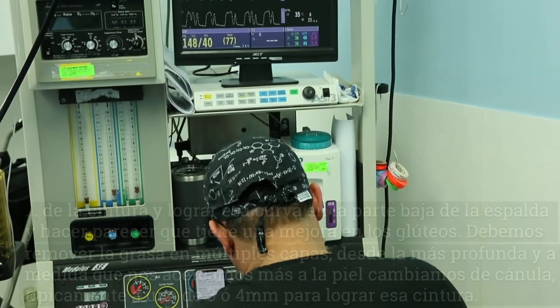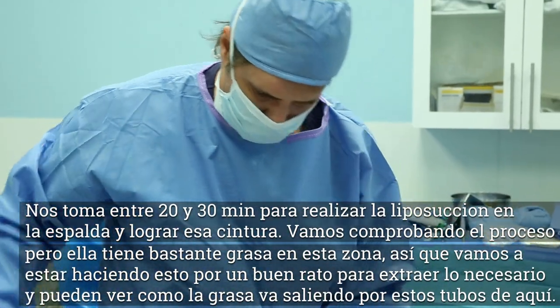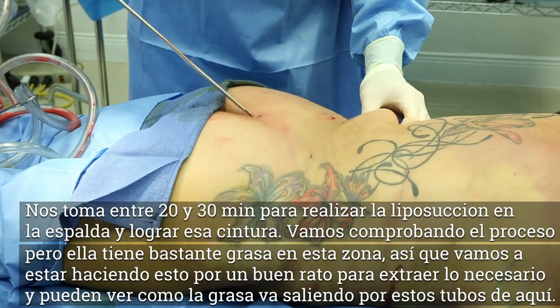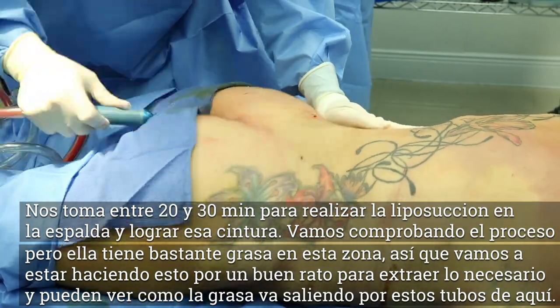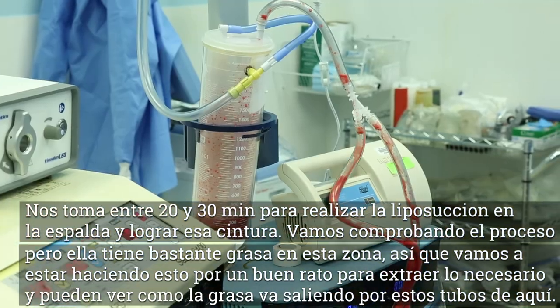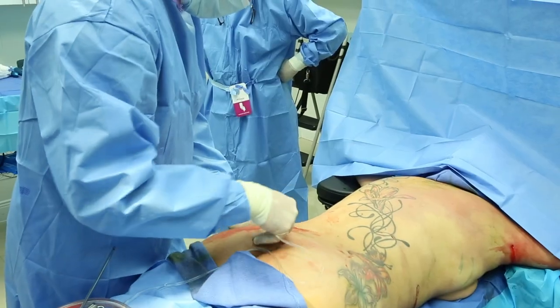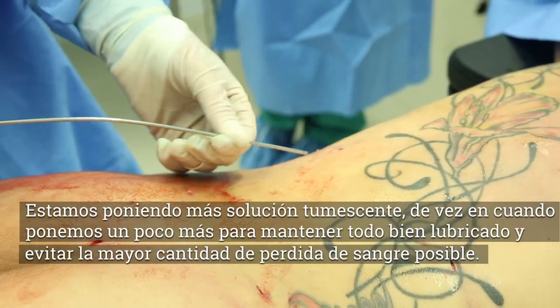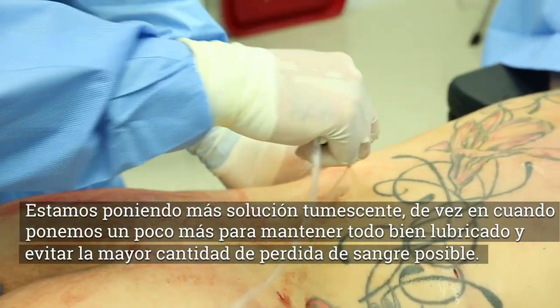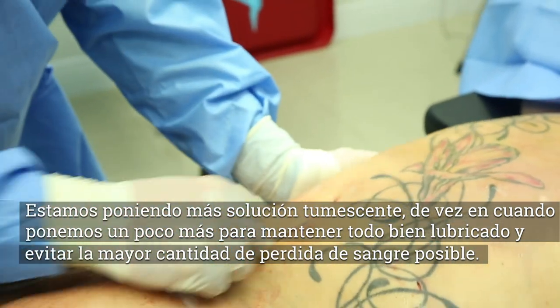It takes about 20 to 30 minutes to do the liposuction on the back to get the waistline. A lot of times I'll check it by lifting up the hips. You can see she has a lot of fat here that we need to get, so we're going to be here for a little while, really carving out that fat. You can see behind me that's where all the fat is coming out through this tubing. This is the tumescent solution that we infiltrate, which helps with the bleeding. Every now and then I'll insert a little bit more to keep things well lubricated and keep blood loss to a minimum.